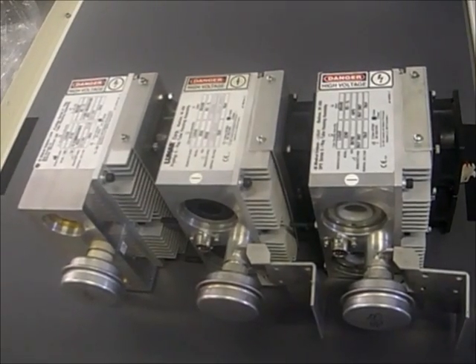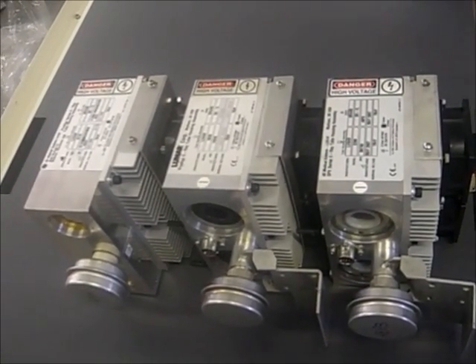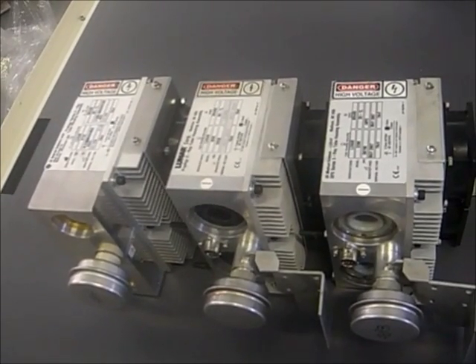Hi, I'm Steve from Complete Medical Services, Parts Division. Today I want to talk to you about tubes. Every day, Complete Medical Services gets called for tube replacement. On your GE bone density system, there are three separate tubes.